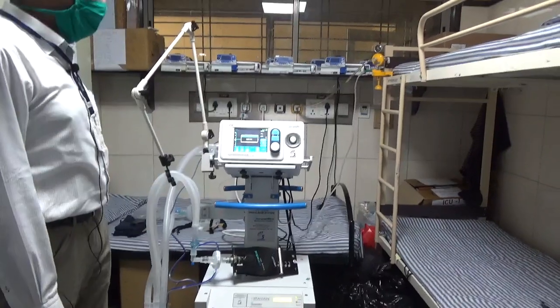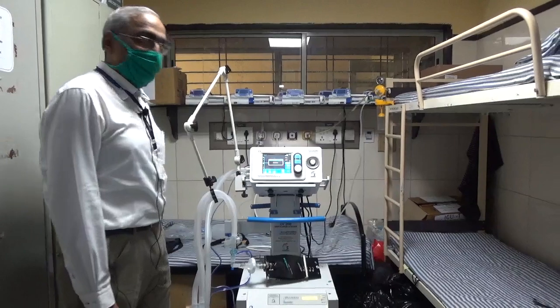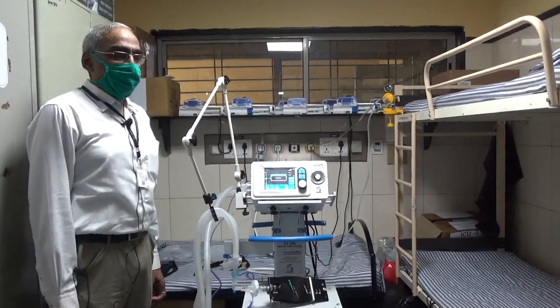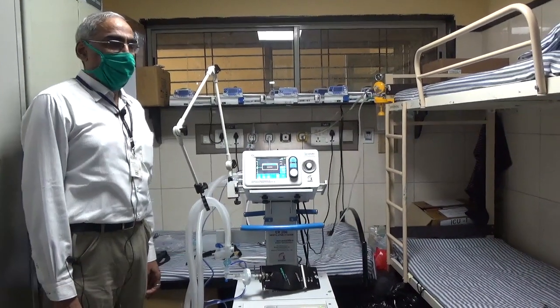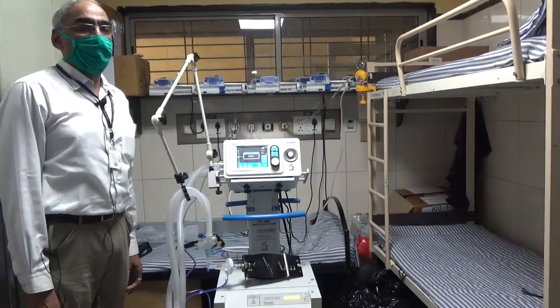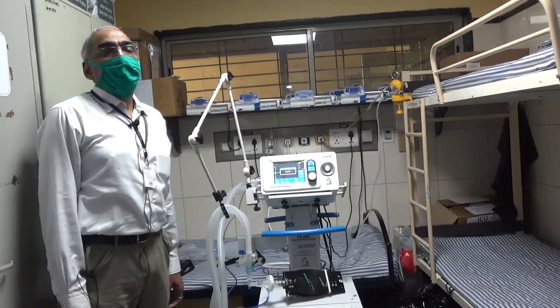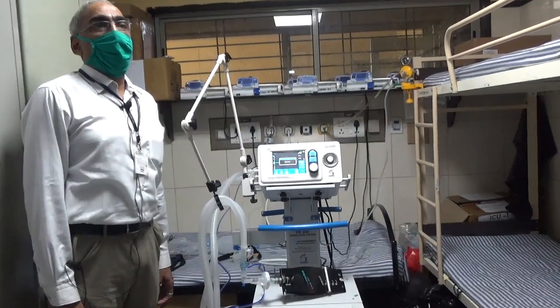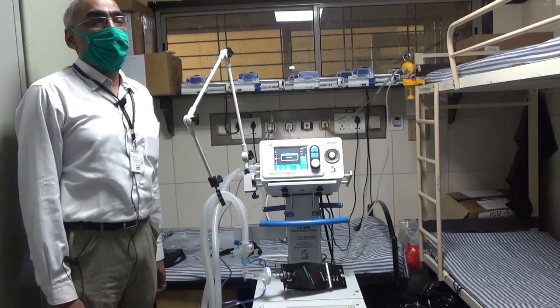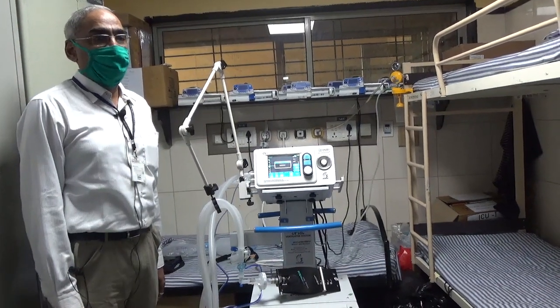Now, for non-invasive ventilation, we have to see how and in what place non-invasive ventilation can be used. When we have patients coming with COVID-19 pneumonia, patients who do not maintain their oxygen saturation on the non-rebreather mask with 15 liters per minute of oxygen, and or they do not maintain on the high flow nasal cannula with an FiO2 varying from 60 to 100%, then such patients may be given a trial of non-invasive ventilation.